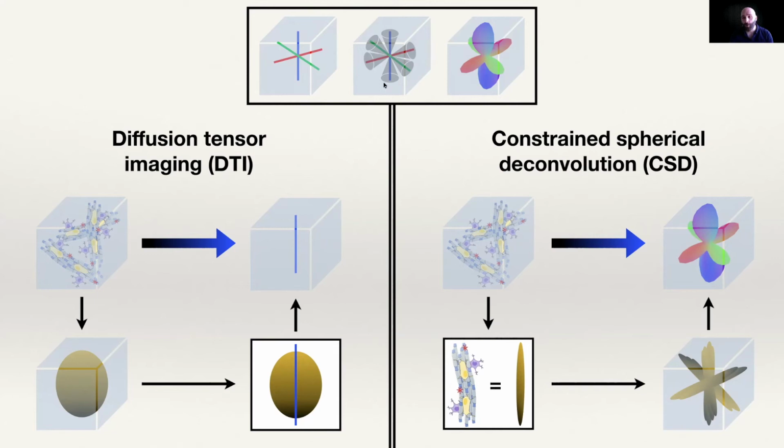For the cones, they are always added artificially. So you have ways, for example, to do tractography using a specific cone angle, and then you can do the same tractography with a sharper or a coarser cone angle. And then you can try to combine all of these tracks that you obtain and then filter out some bad ones. They are starting to have pretty efficient algorithms to filter out tracks that don't make sense with regards to some prior information. So it is one way, but keep in mind that this cone is very artificial. These ones are more natural to some extent when it comes to representing information.